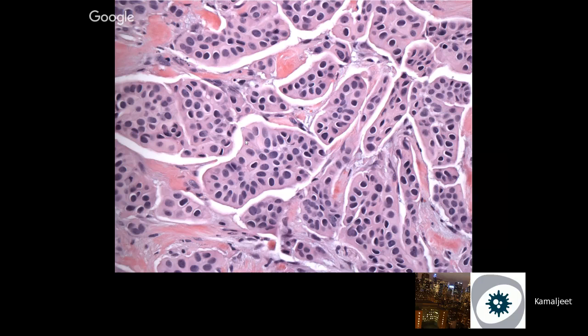Typically the tumor cells are dense. There are a lot of tumor cells in very little area. Each cell cluster makes this micropapilla with reverse polarized tumor cells, by which I mean that the luminal surface of the normal cell is actually towards the stroma, and nuclei are towards the center of that micropapilla. And typically they're floating in this empty space or retraction cleft.